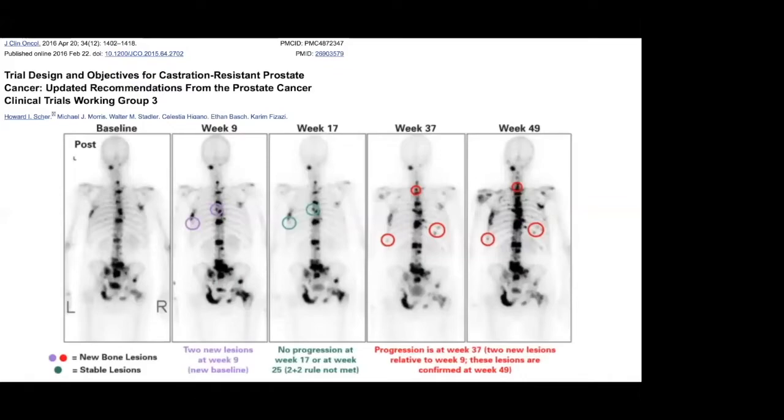Right, so then moving on to treatment response. Again, for treatment response assessment, the bone scan plays a very prominent role. That does give some issues because not only is a bone scan less sensitive, as has been clearly shown, but also to see a difference, a response in a lesion, is quite difficult. Nevertheless, the bone scan is pivotal in almost any clinical trial, and the Prostate Cancer Working Group has developed these criteria, which are a bit confusing, I think.